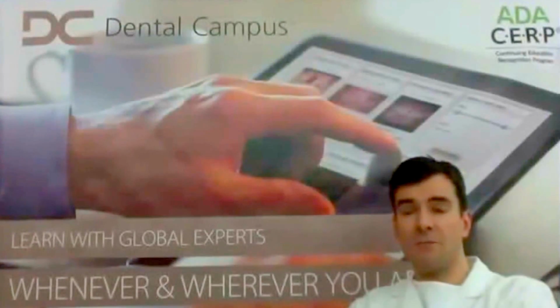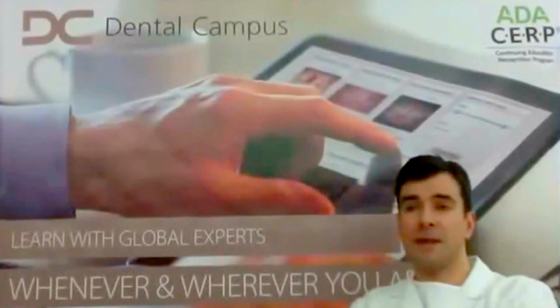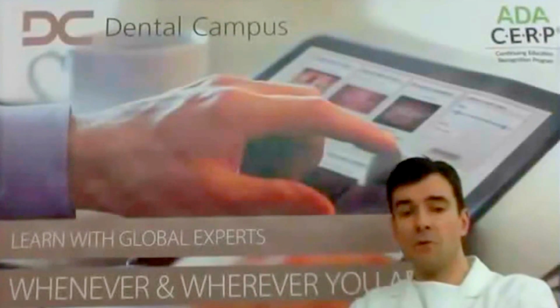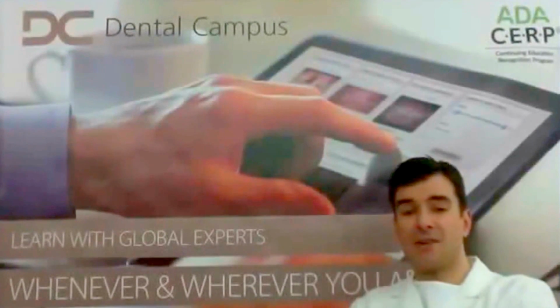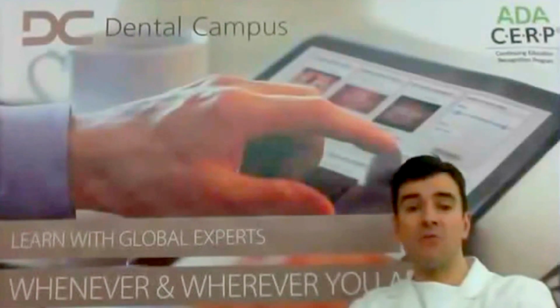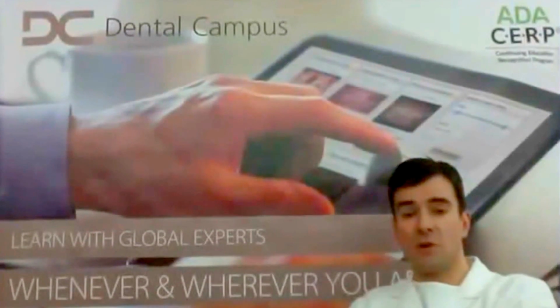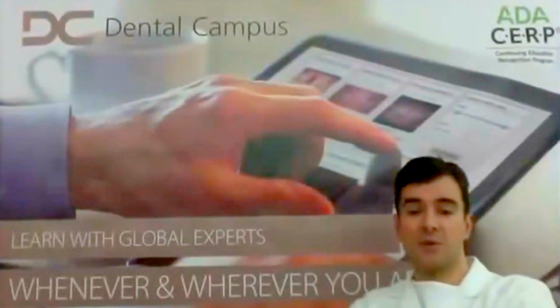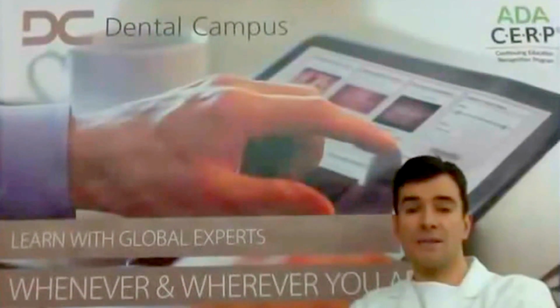Basically it's like a physiologic reaction, and the amount of post-surgical bone resorption is higher in situations with thin mucosa, but pretty much all the cases end up with 3 to 4 millimeters of biologic width. So to answer the question, yes, in cases with thin mucosa, you should place the implant deeper.